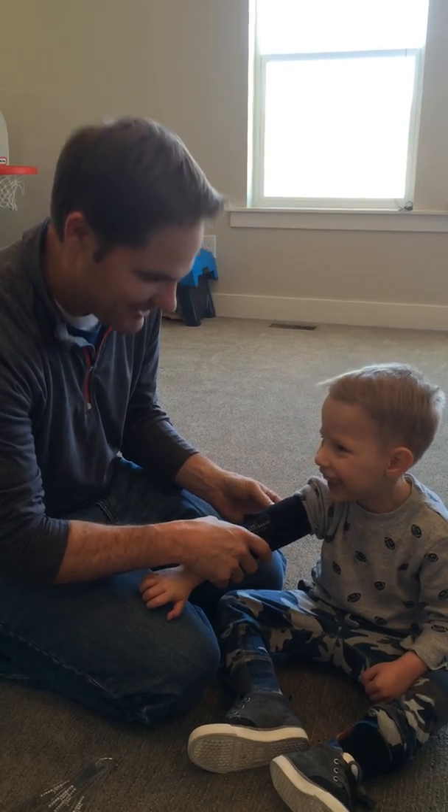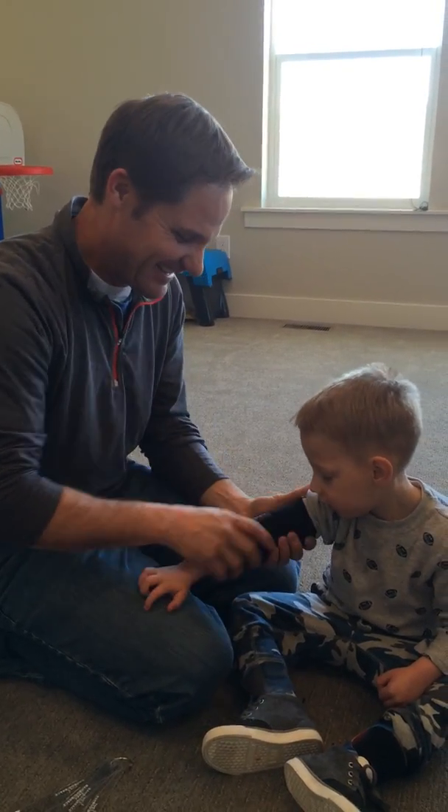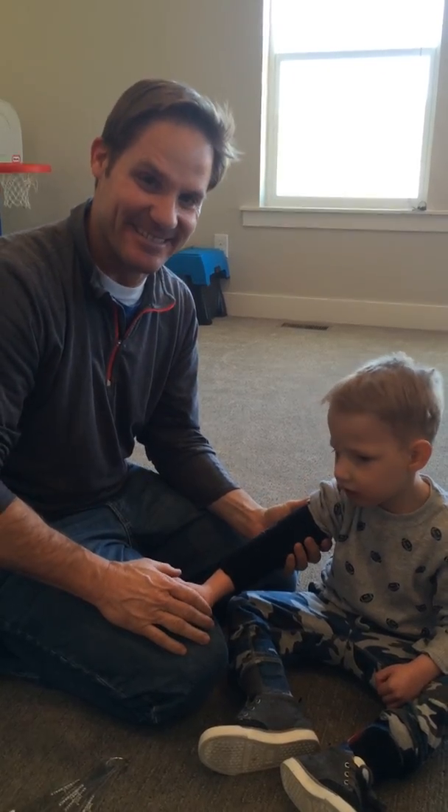How's it feel Bronson? Great. That's perfect. Nice job. And we're ready to go. Perfect.